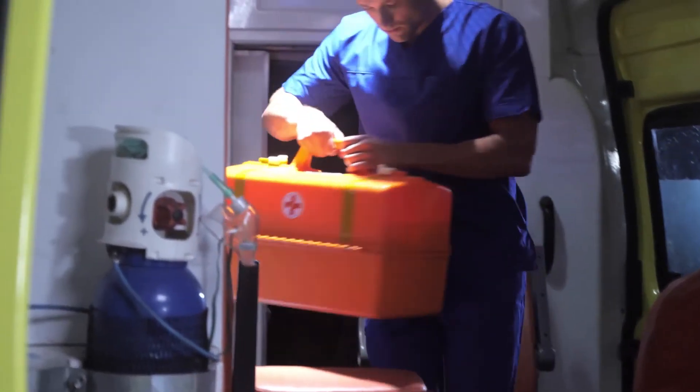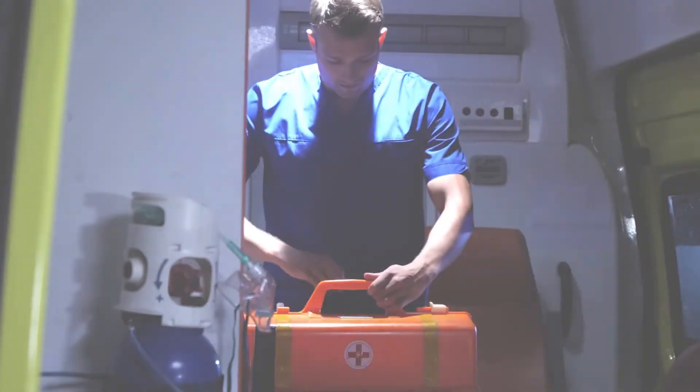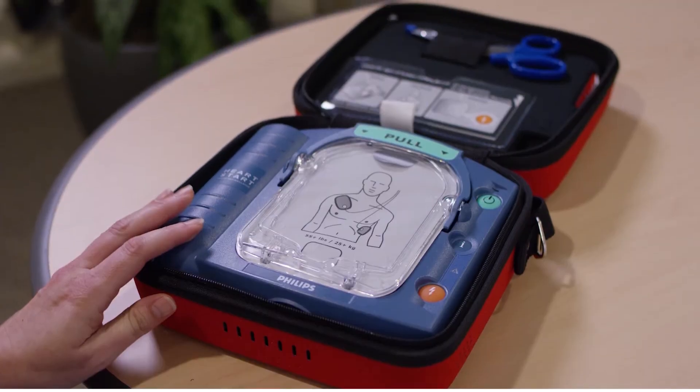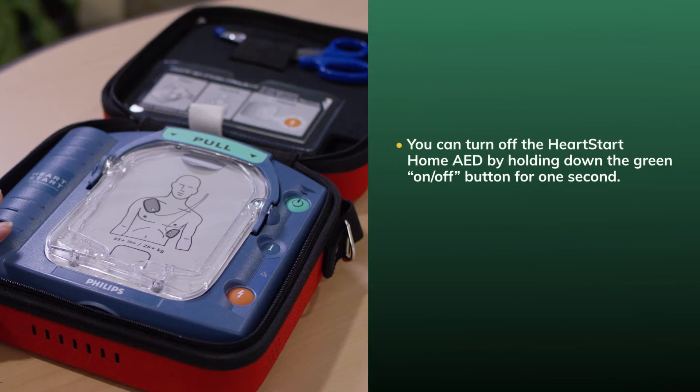When emergency medical personnel arrive, explain to them what happened as clearly as possible. Inform them that if they hold down the blue I button, the device will report how long ago it was activated and how many shocks were delivered. After the victim's care has been transferred to emergency medical services, you can turn off the HeartStart Home AED by holding down the green on-off button for one second.